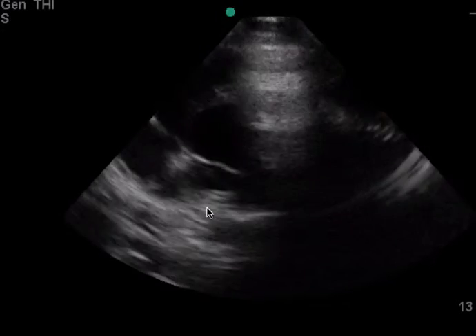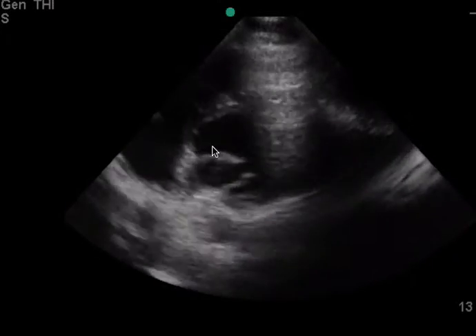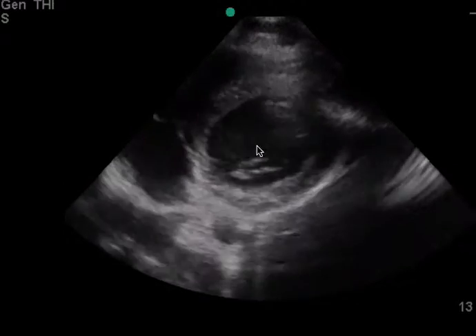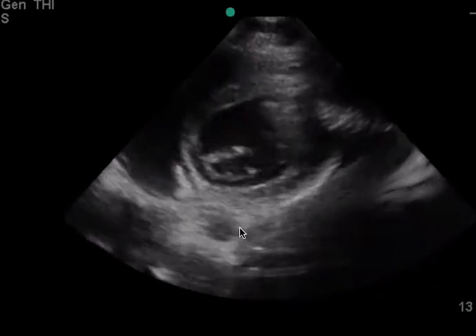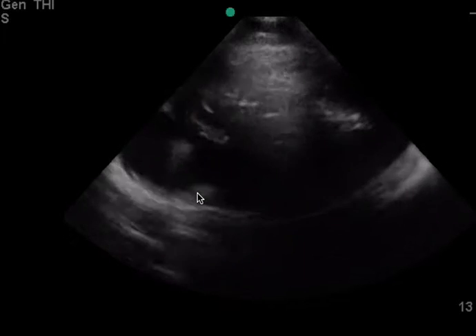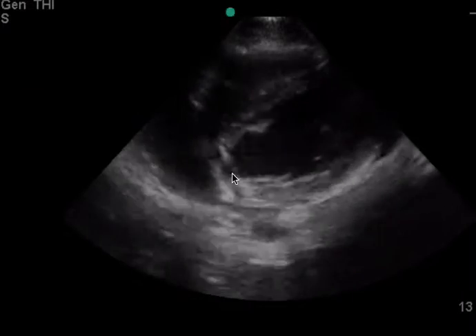You also have some echo images. This is an oblique view. I think you're trying to go from the parasternal long to the parasternal short. You can tell that even though it's oblique, there is good squeeze. There's no fluid around the heart. You can see the descending aorta, and there's no fluid behind it. But I would recommend to try to change the orientation. We'll go over that a little bit more, especially in this view.